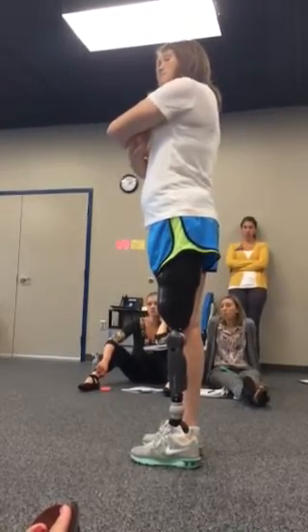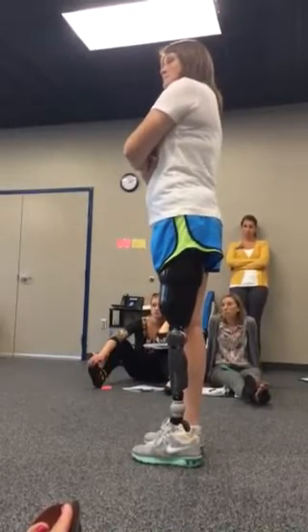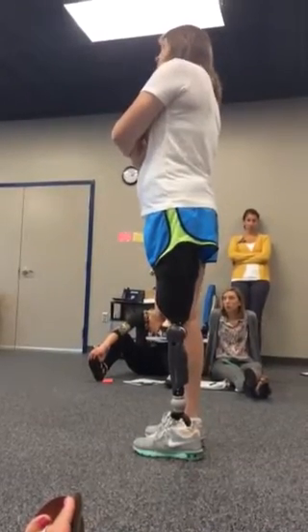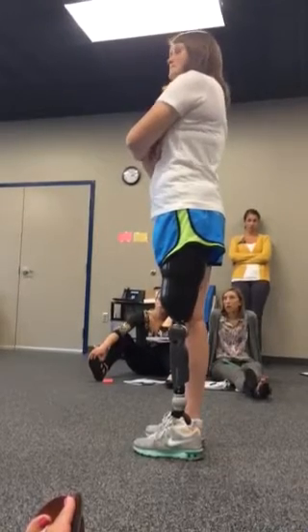So is she keeping her toe down? And is she getting good knee flexion as she comes through? The heel rise from my perspective looks good. You can see the bottom of both of the feet. From the back, you can look at the bottoms of the feet and see how much of the bottoms of the feet you can see.